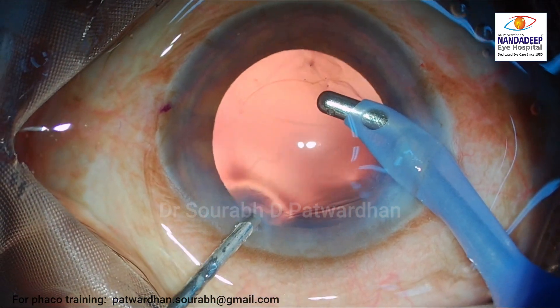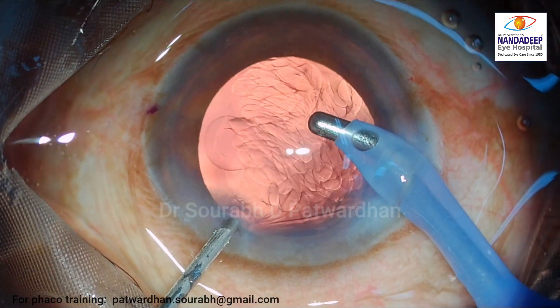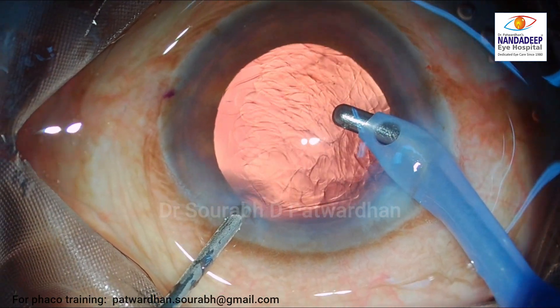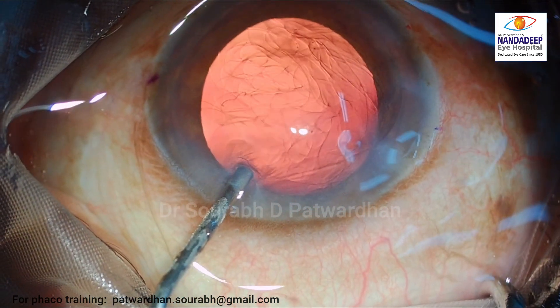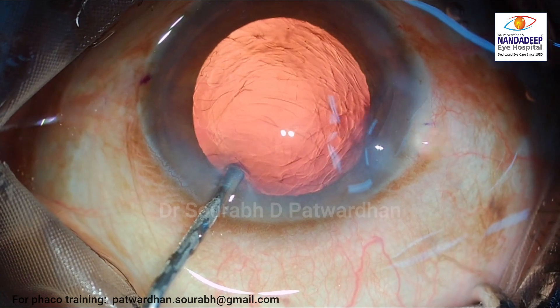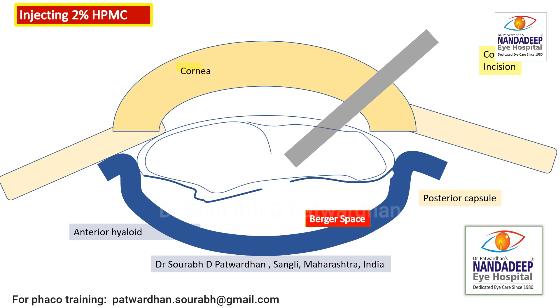This is a very important step which we should practice even in routine cases. Watch how I injected using the non-dominant hand — 2% HPMC is injected, irrigation is stopped, and the entire chamber is kept filled even when we remove the IA probe. The same thing is shown here in the animation.